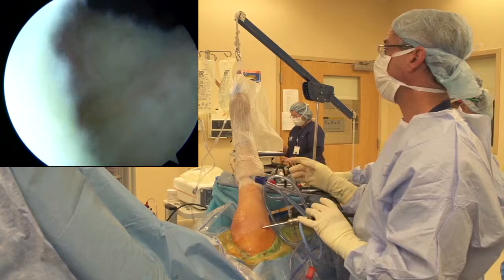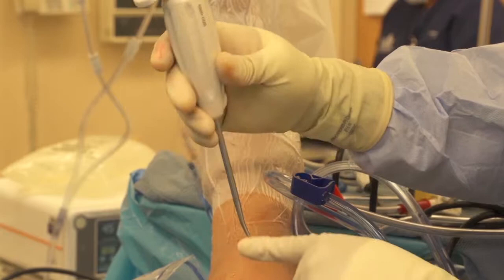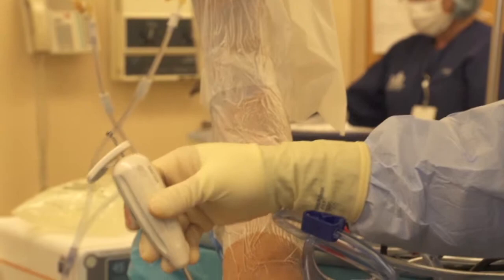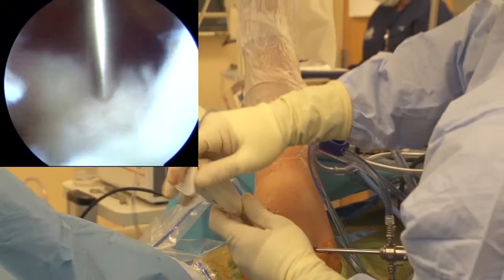Let's just take the nanofracture device without the cannula for starters. Here's the actual device itself - the arthrosurface nanofracture device. This guitar pick is an excellent device because we're going to get down onto the humeral head perpendicular to the actual bone itself. You want that perpendicular to the cortex. We then bang it in with a mallet, and then the guitar pick is a nice way of being able to disengage it from the cortex. We're going to put this in using our standard technique, get ourselves into a perpendicular fashion, take our mallet, and seat it - it's a very easy seat. Push down on the guitar pick, and out it comes.